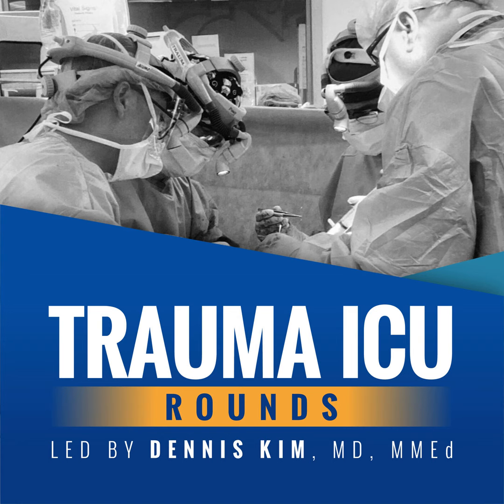Now, compared to pressure triggering, flow triggering may actually be a little bit more comfortable or at least require less work. Typically, the trigger is set at somewhere between 1.5 to 3 liters per minute. And I think that's really the one thing to bear in mind, that when it comes to triggers and patients triggering the vent, the flow trigger typically requires a little less work.